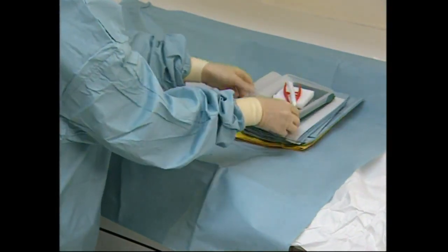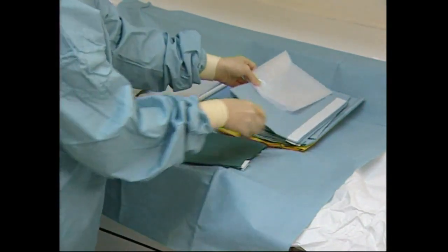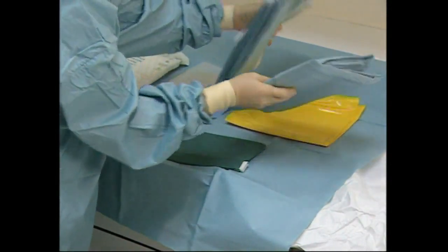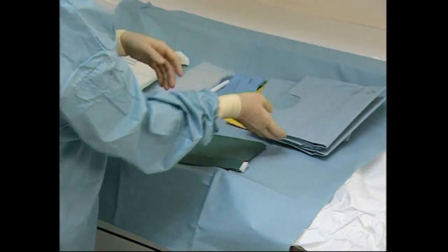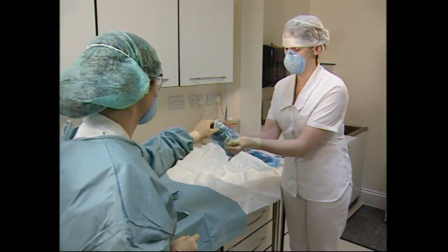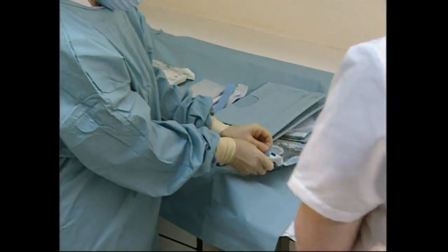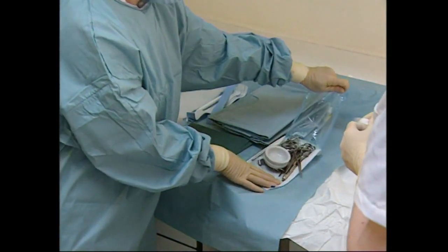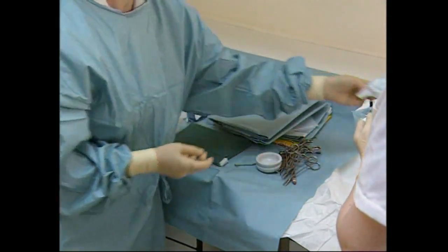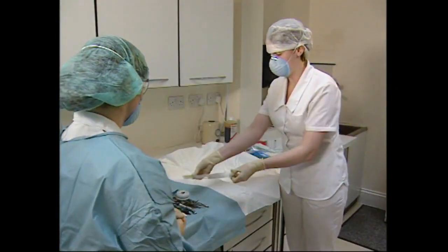The suction tip, plastic tray, gauze, light handle covers and additional drapes are sorted. Instruments may be sterilized in an autoclave, double bagged and autoclaved again to the recommended protocol in a vacuum autoclave with a drying cycle. Alternatively, instruments may be used directly from an autoclave, sterilized at the recommended temperature and pressure. The use of double bagged instruments is demonstrated here. The roving assistant opens the outer bag, presenting the surgical assistant with the inner sterile pack which is taken, placed upon the sterile drape and opened. Additional instruments are passed over, maintaining the barrier between the sterile and non-sterile environments.